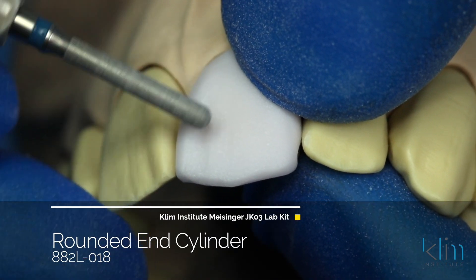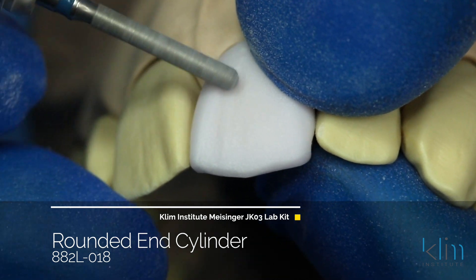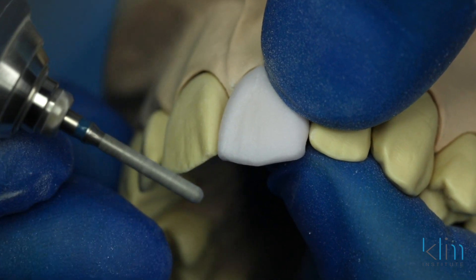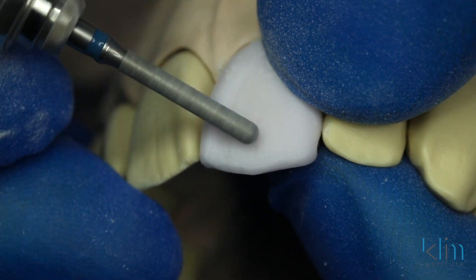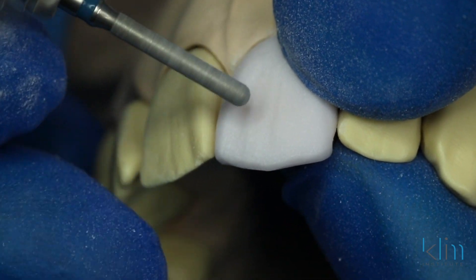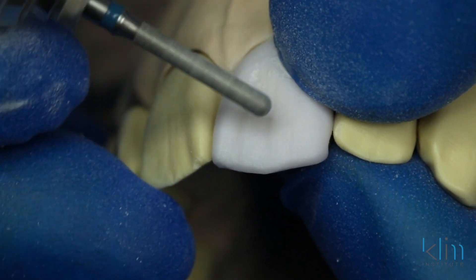Once we've completed our primary groove definition, we're going to go to what we call texturing. This case is great for texturing because if you look at the tooth next door, it has all these little ripples — like ripples on water on a semi-windy day. The technique I use for that is the end of my diamond. I find that a pencil grip is really advantageous for refined texturing — it's more like a drawing technique. With that pencil grip, just draw in and replicate what you see next door using different strokes. Whenever I scribe a more defined texture, always scribe and then scrub around what you scribed — that keeps it looking more natural.